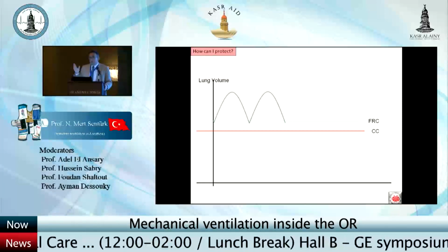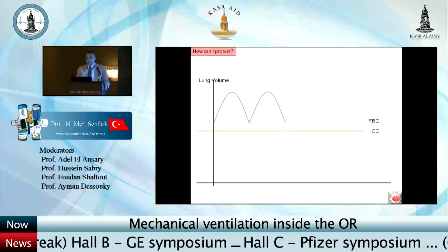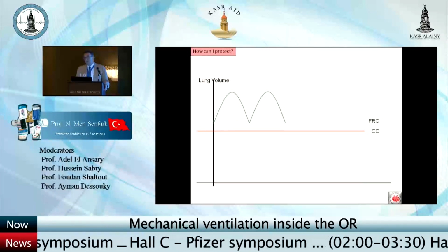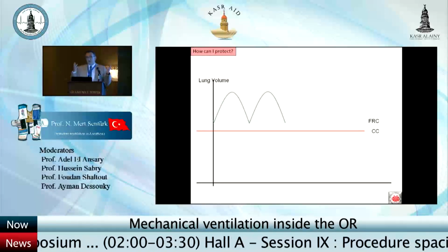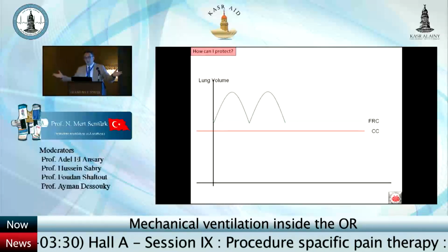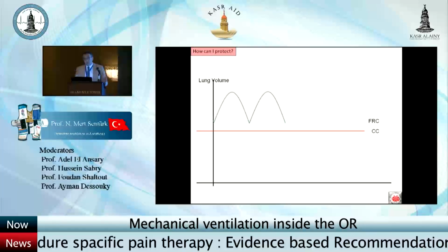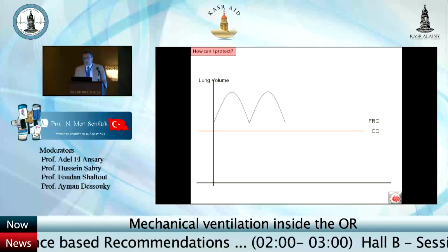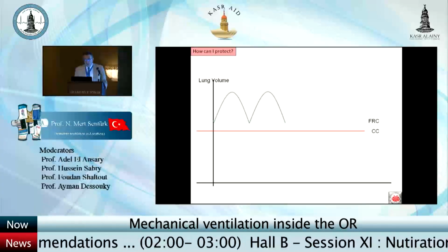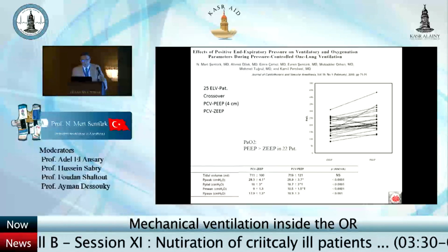To prevent the atelectasis, to prevent that sleep, I have to give some pressure to my tone. And with this pressure, with this PEEP, I hope that my audience, the alveoli here, would not sleep. Therefore, some PEEP during mechanical ventilation is something like my voice during my lecture, and this would keep the alveoli open. There's something about recruitment, we will come there too.